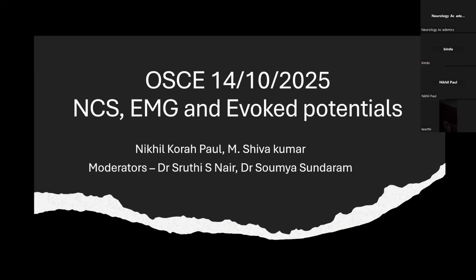Session. Today we'll have an OSCE on electrophysiology. We'll be having 30 questions on NCS, EMG, and evoked potentials. It will be presented by myself, Nikhil, and Shivakumar, and the session will be moderated by Sruthi ma'am and Soumya ma'am.